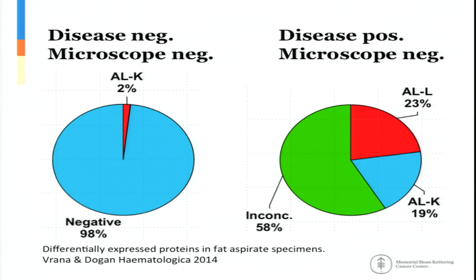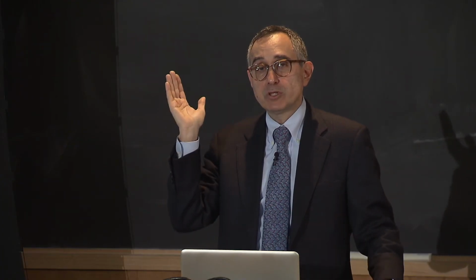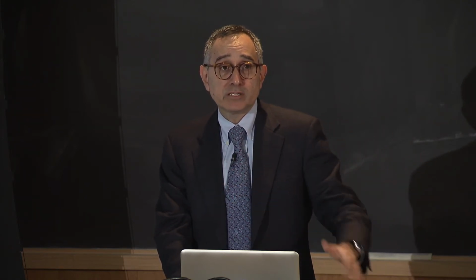So if we get this, it is an indication to go and do a targeted biopsy for the heart or kidney or whatever, because we may not have it in the morphology of the fat aspirate, but we have the proteome of amyloidosis. That's an indication for the patient to have a more aggressive biopsy. By itself, I can use it, but I think it will take a lot of other validation and a larger number of cases to be able to convince people to change medical practice from a microscopy-based thing into a comprehensive proteome-based diagnosis. But it is doable, but it will require energy and resources that at the moment I do not have.